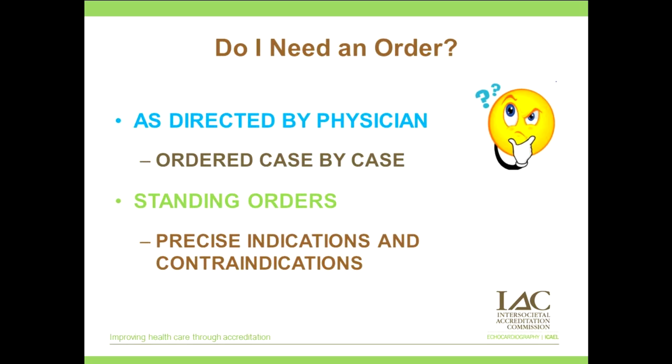So either standing orders or orders that are case by case as directed by the physician is really going to be lab dependent. And it comes down to really what works best for your lab.